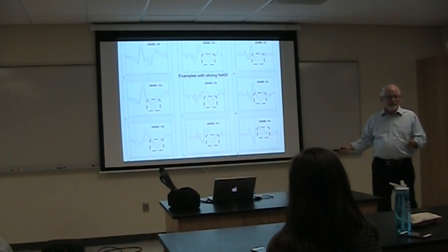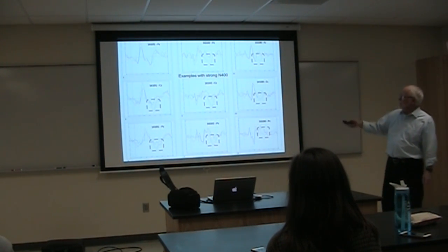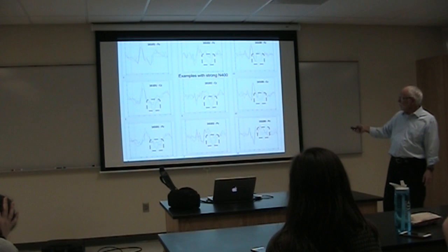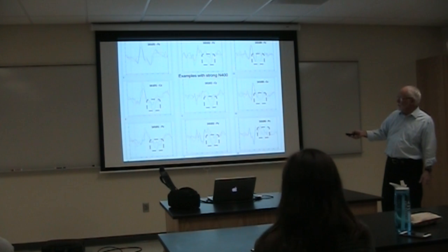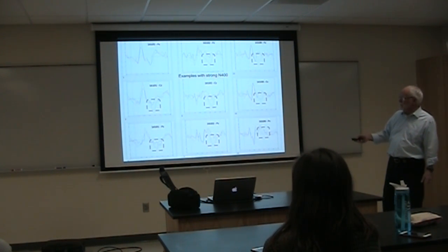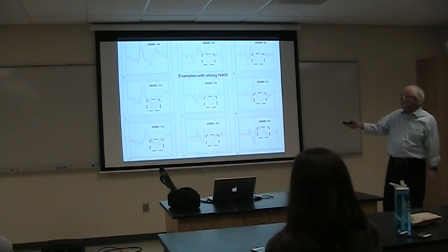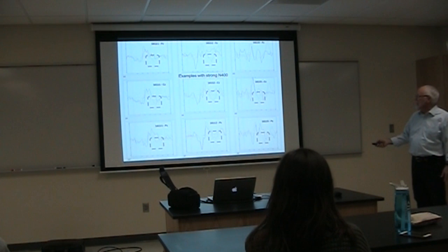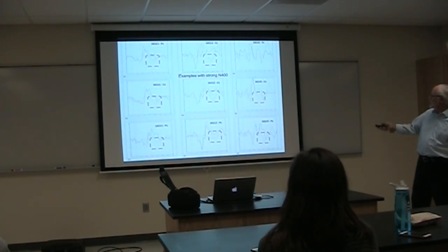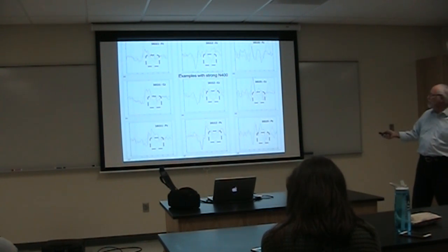Just quickly before I quit, let me show you the results from last semester where we did the same experiment that we did here. Once again, what I'm showing is the 3 positions, FZ, CZ, PZ, for each one, because I wanted you to see that this particular participant showed a pretty clear N400 at the position CZ, center, PZ, more posterior in the parietal lobe, but not really in the frontal lobe area. The next two showed it in all three, but here's a person, once again, who showed it pretty well in the CZ and PZ, but not in the frontal area.